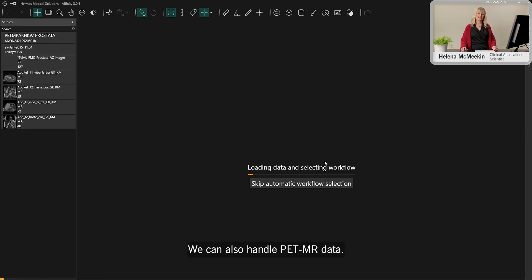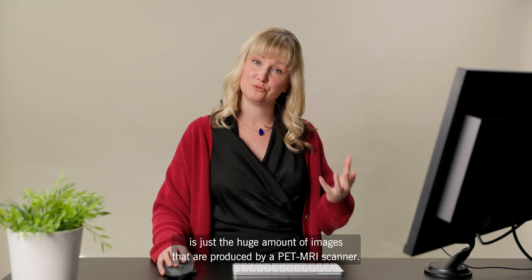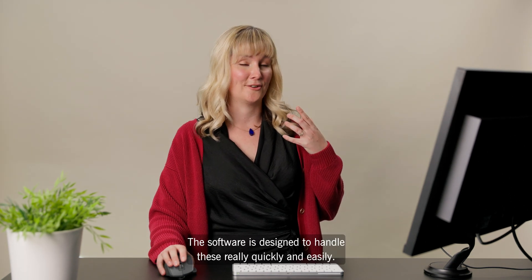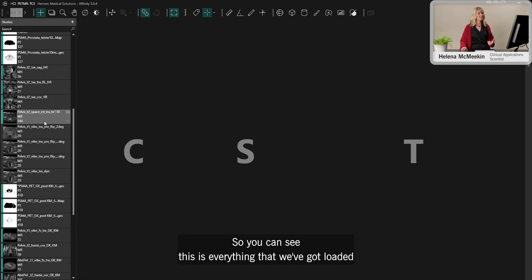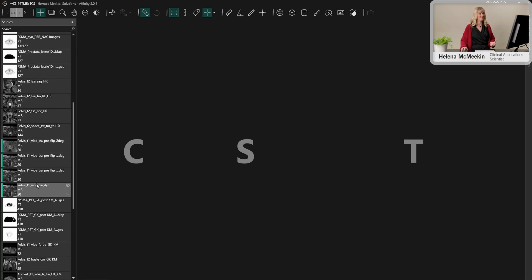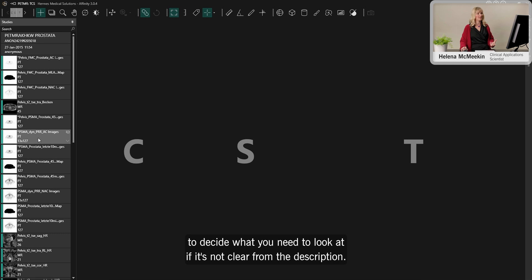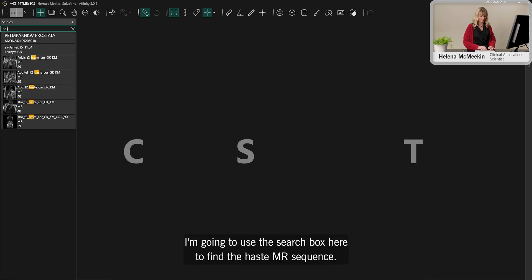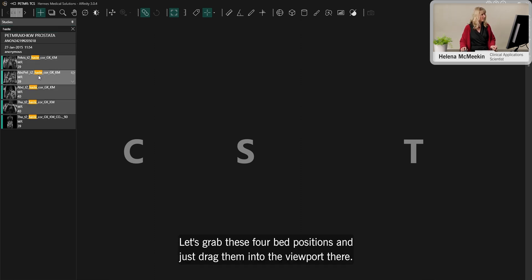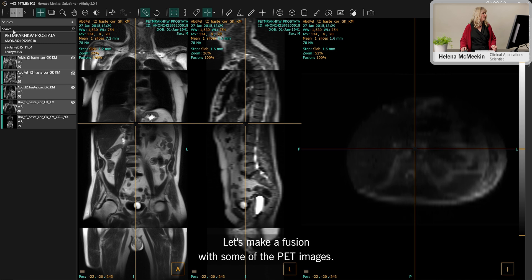The software can also handle PET MR data. One technical challenge is the huge number of images produced by a PET MR scanner — the software uses graphics cards to handle these quickly. All loaded images appear in the data tree on the left, and you can preview thumbnails to decide what to view. Using the search box, I find the HASTE MR sequence, grab the four bed positions, and drag them into the viewport.